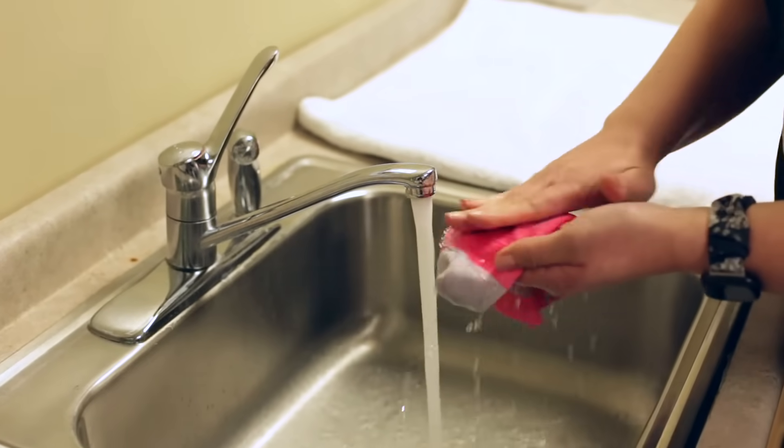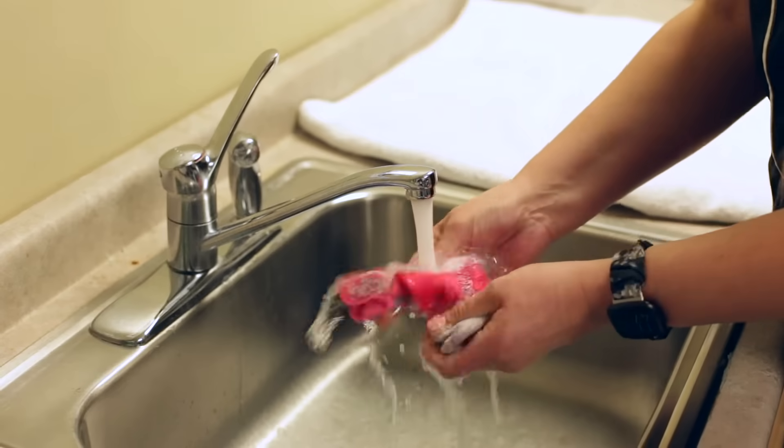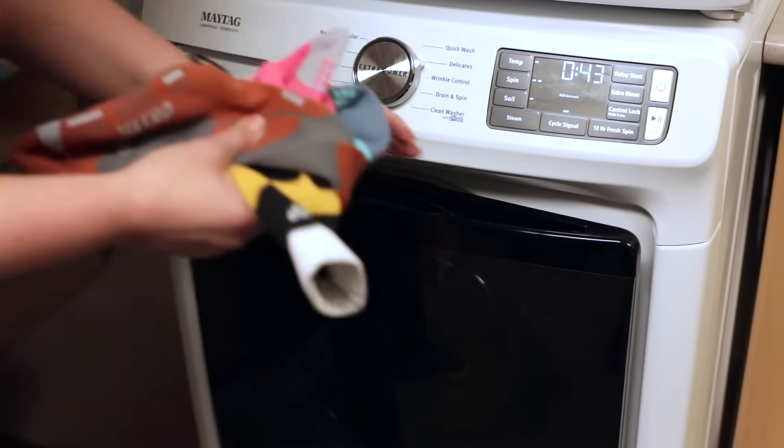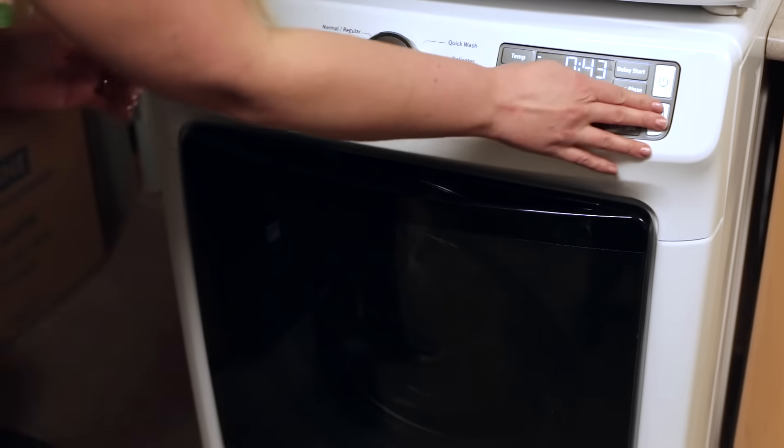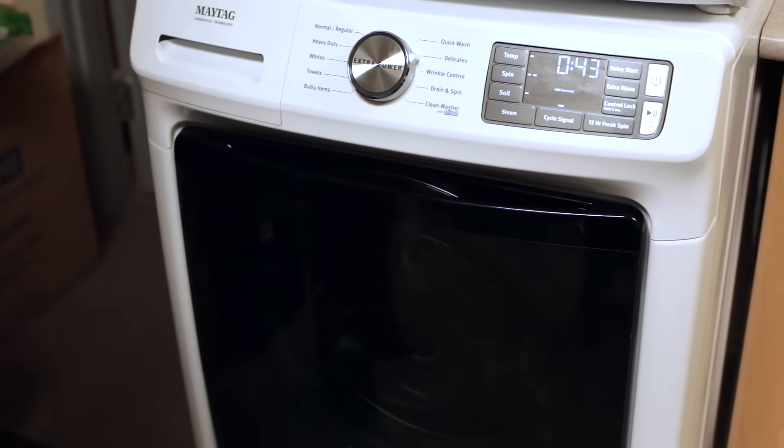To wash your medical compression socks, you can either hand wash them in cold water or machine wash them on a gentle cycle in cold water. If you have a mesh laundry bag, this would give extra protection.